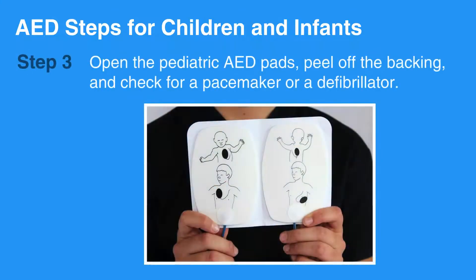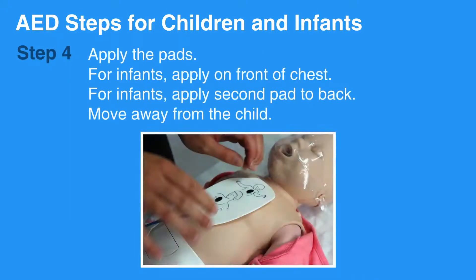Then, open the pediatric AED pads, peel off the backing, and check for a pacemaker or a defibrillator. Apply the pads. Apply one pad to the upper right chest above the breast. For infants, apply in front of the chest. Apply the second pad on the lower left chest below the armpit. For infants, apply a second pad to the back.